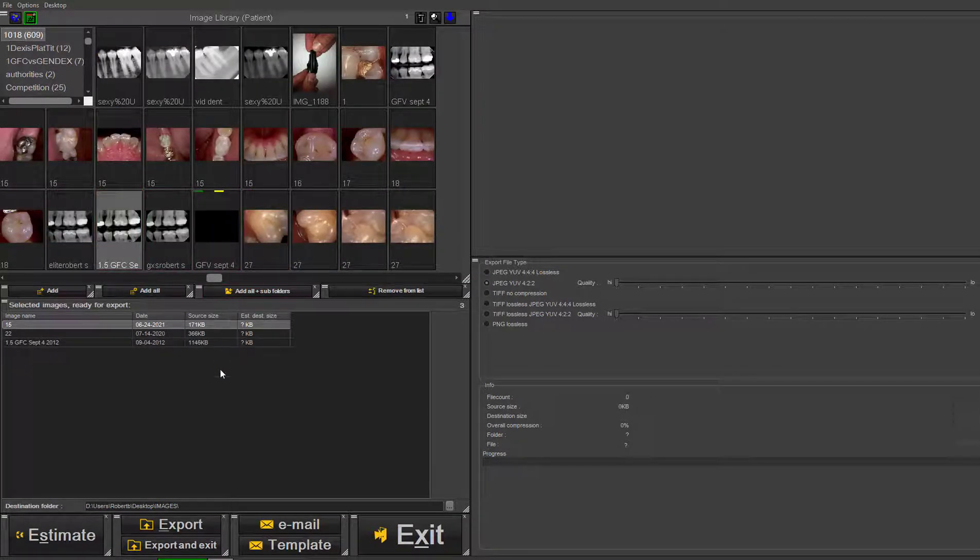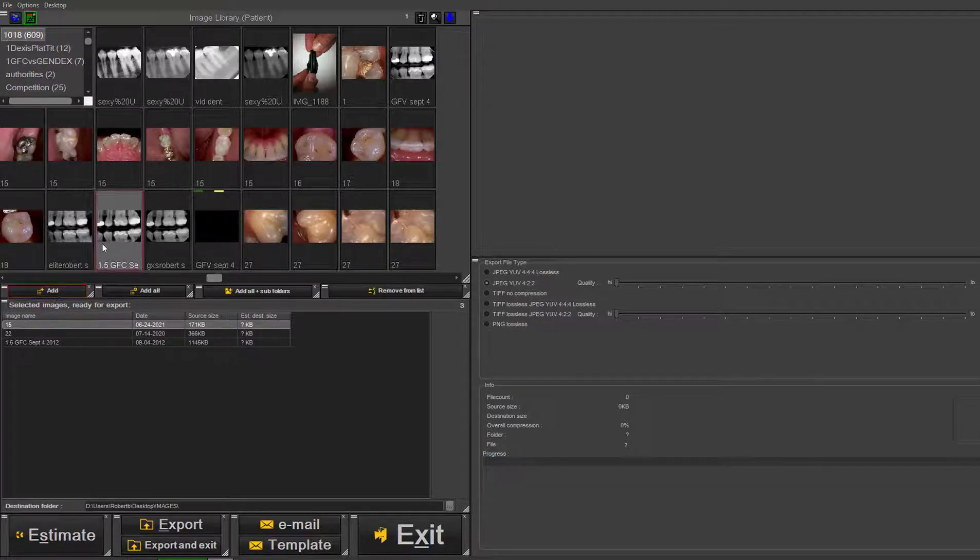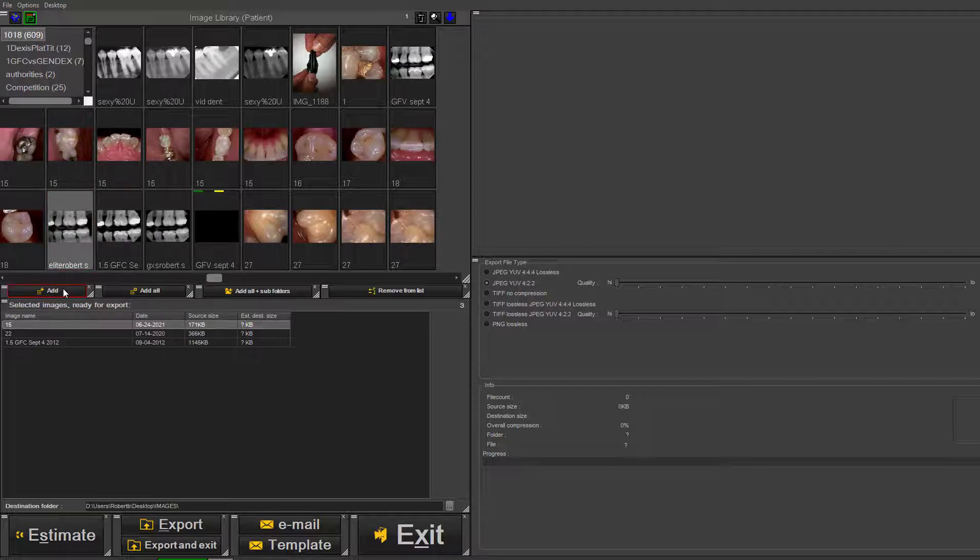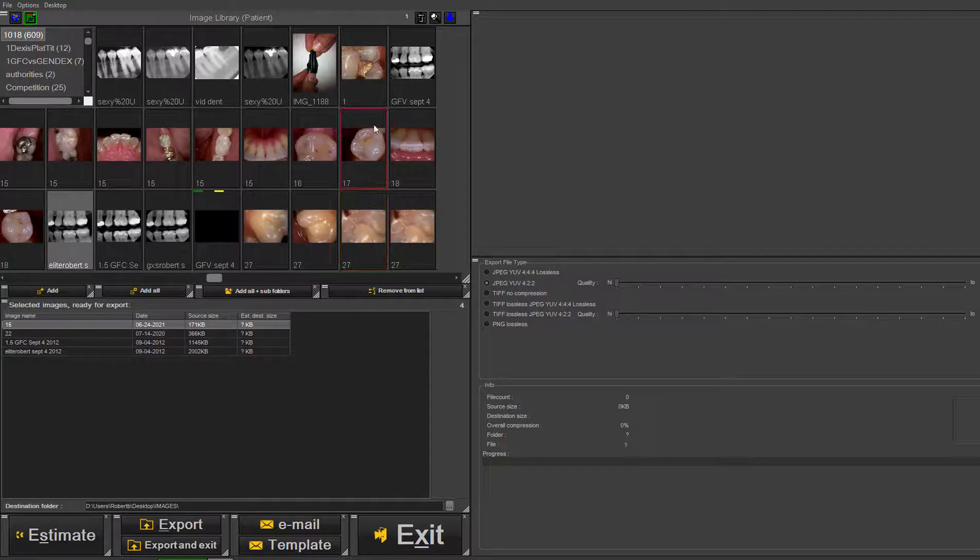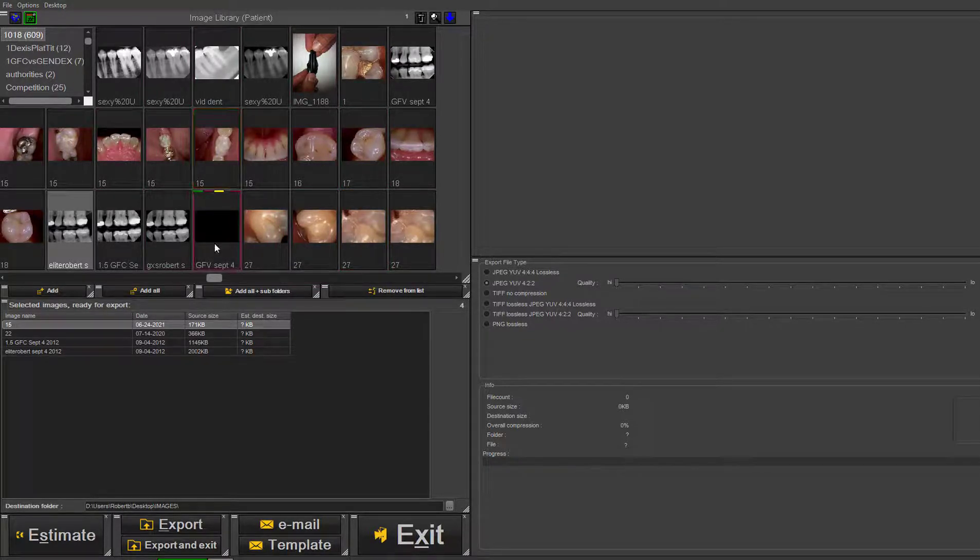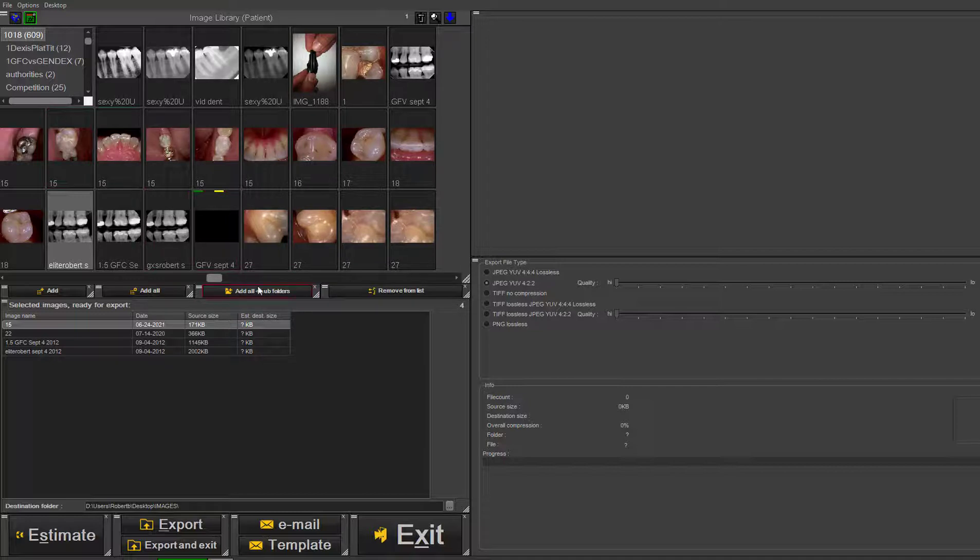You can also choose 'Add' as another way instead of right clicking. If you highlight and click 'Add', it will add it to the list. You can 'Add All', which will add all the images within the library including subfolders if you want.